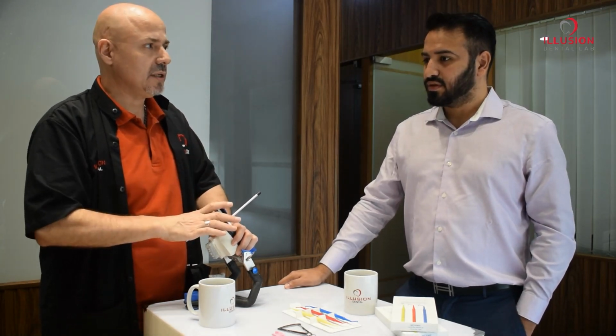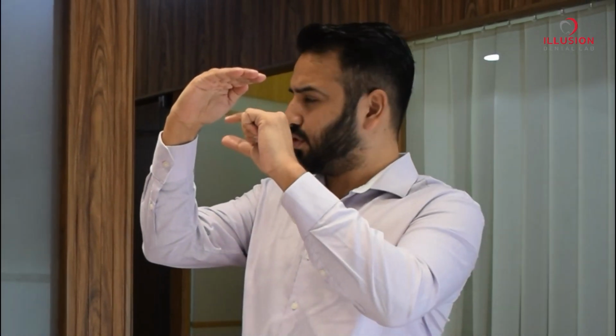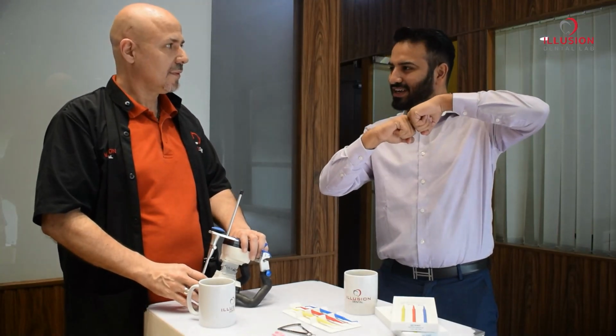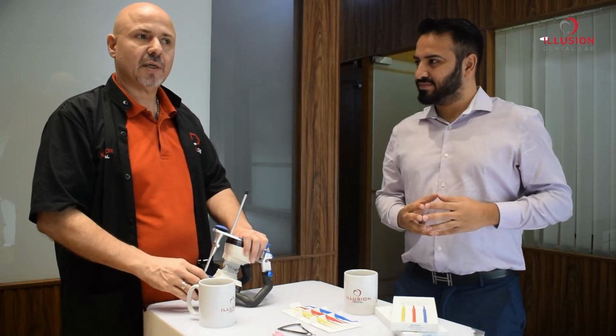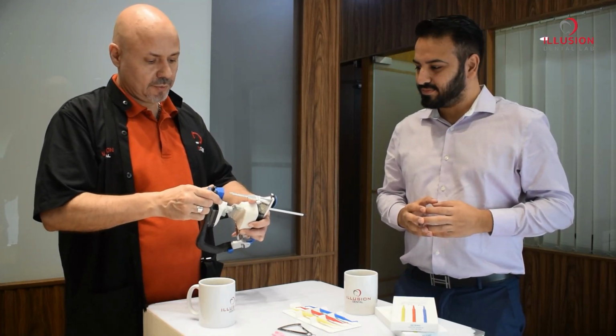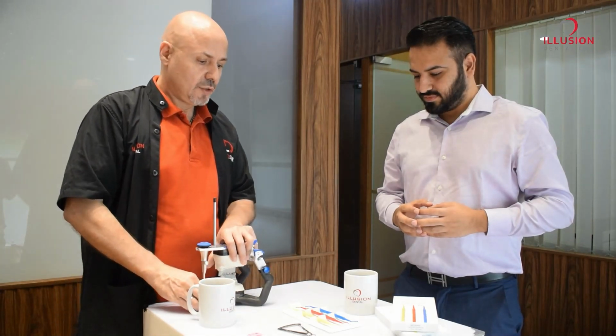I think 1 millimeter is kind of safe, yes, because you not only have to cover the occlusal clearance that gives us the gap for this virtual spacer, but also for a minor disocclusion. Let's face it, a good disocclusion is required, right? Correct. So the 1 millimeter I think is a very good measure to stick to. So that is one.